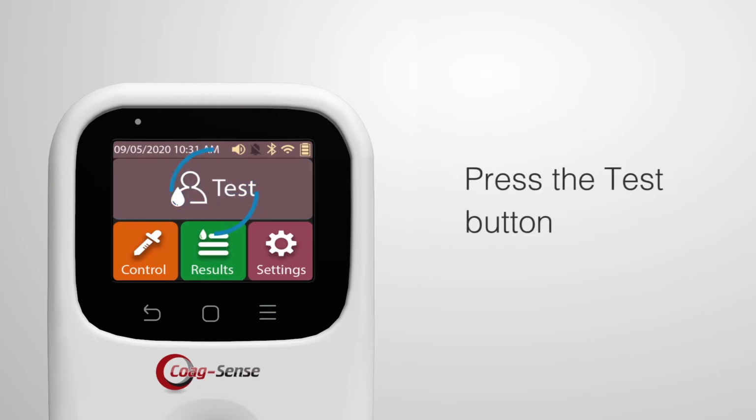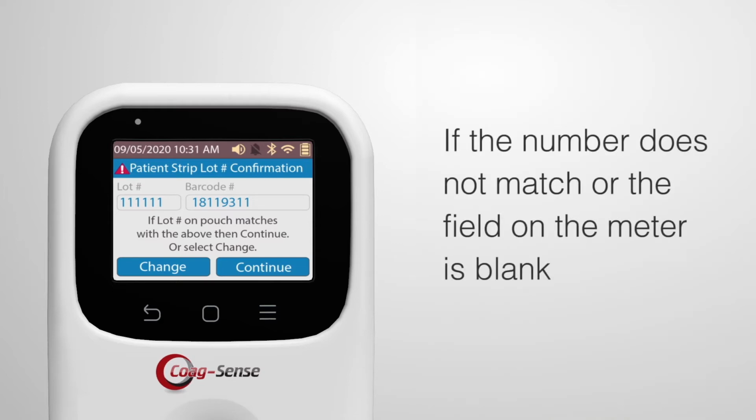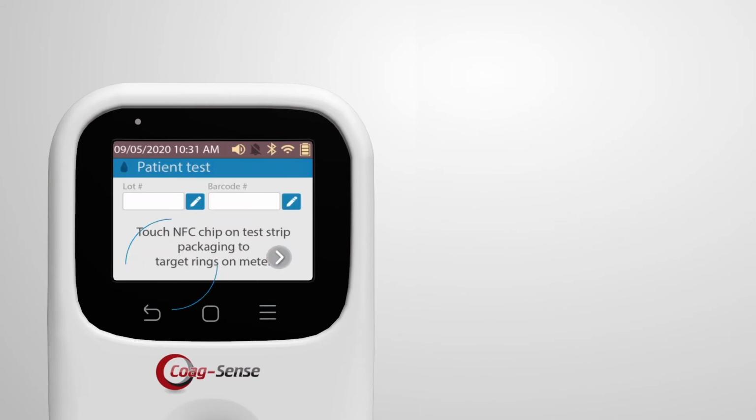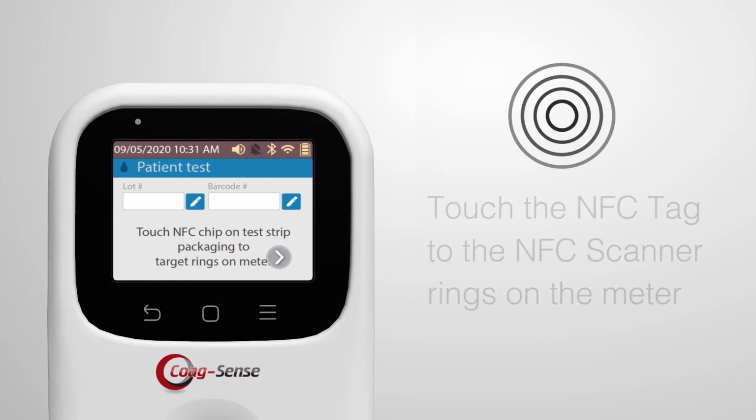Press the test button. Confirm that the patient strip lot number and barcode number display matches the information on the test strip pouch. If the number does not match or the field on the meter is blank, then touch the NFC tag to the NFC scanner on the meter.